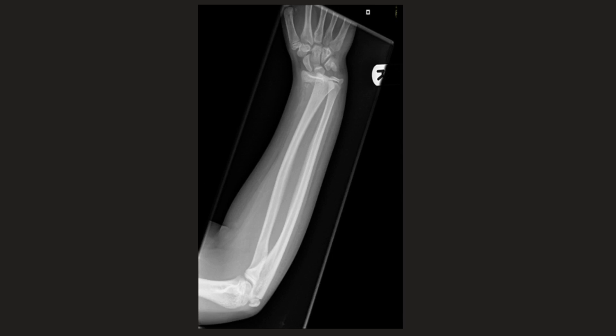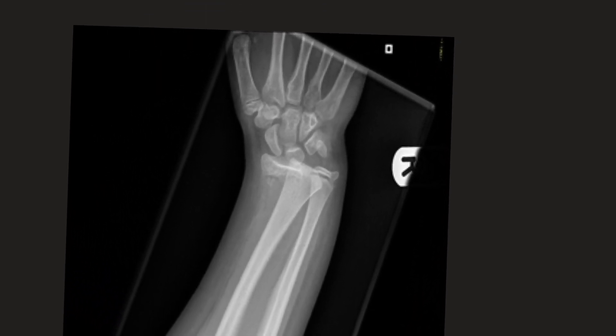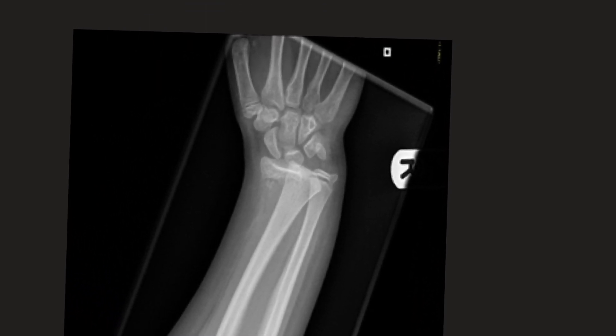Looking at this forearm x-ray, if we just zoom up to the wrist, we can see there is a definite displaced fracture there, going through the actual growth plate, with some of the metaphysis involved as well. Again, this is in keeping with a Salter-Harris type 2 fracture of the distal radius.